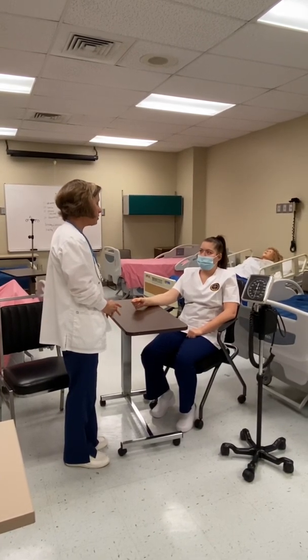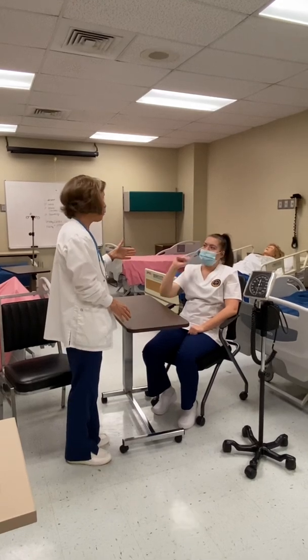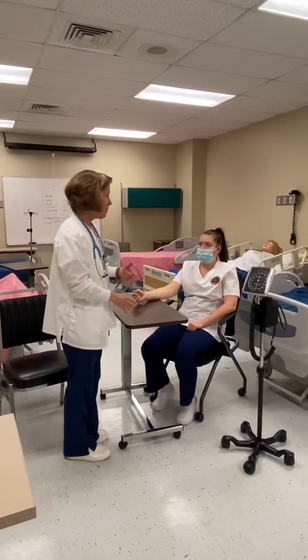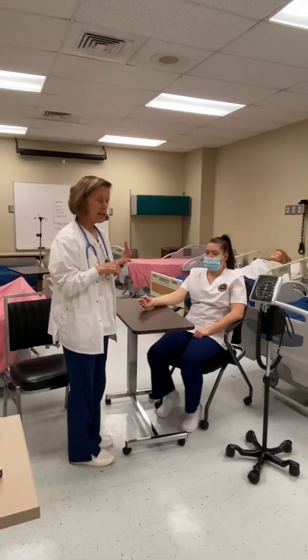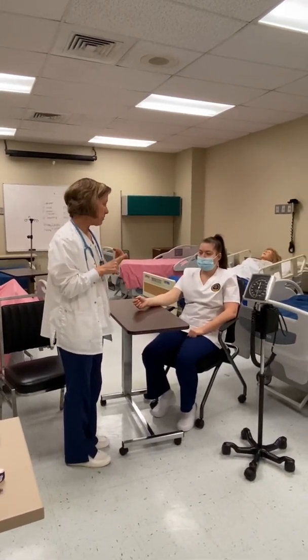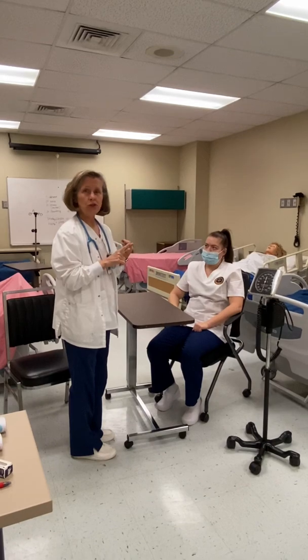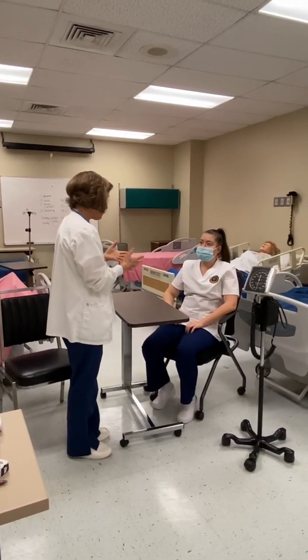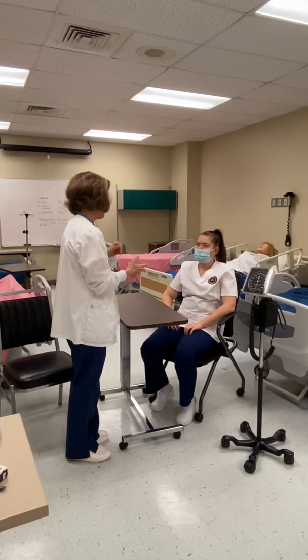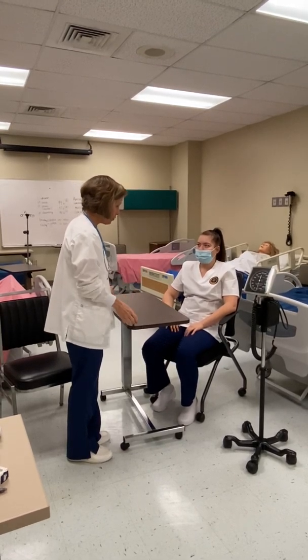I'm going to ask her if there's any reason why I shouldn't use one arm or the other. If my patient has an IV, a dialysis shunt, or if they've had a mastectomy on a certain side, I would not use that affected extremity. 'Is there any reason why I can't use your right arm?' I think I'll use your left arm today.